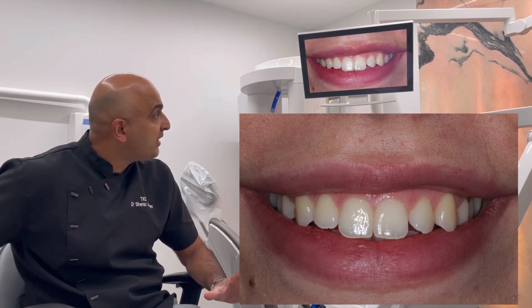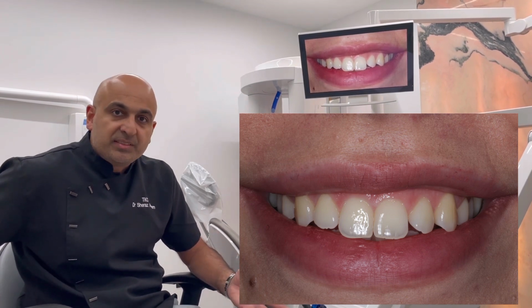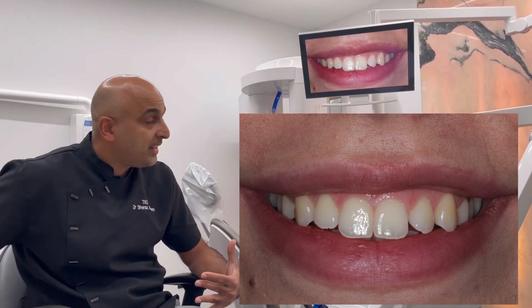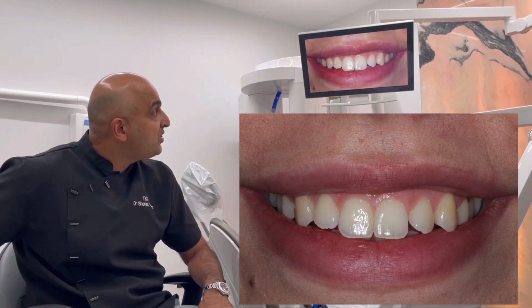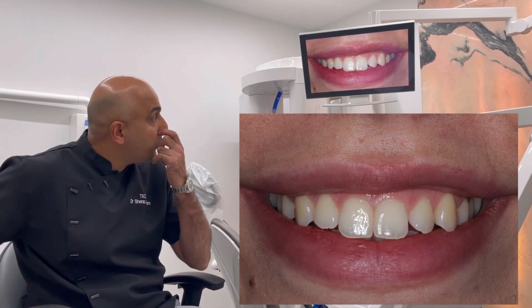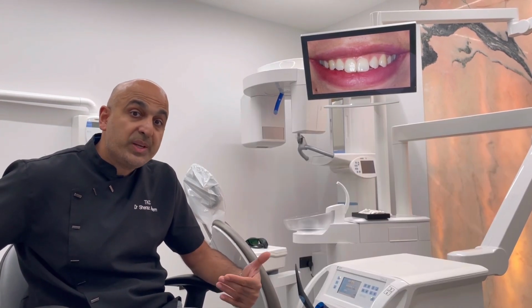Now, why did we choose Invisalign? Because for alignment in this type of case, Invisalign is totally fine. It's not going to be too difficult. It's going to take about 3 to 4 months just to get these teeth aligned. But what I also knew is once these teeth are aligned, these two teeth will become a problem because they are not the shape that the patient wants. So the discussion then was, what do we do? How do we fix that? Well, we've got two options. We either do some composite bonding or we do ceramics.